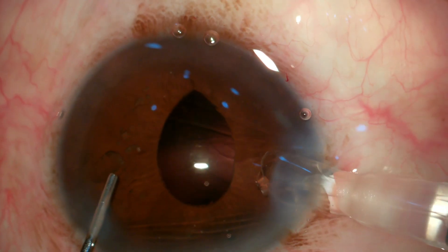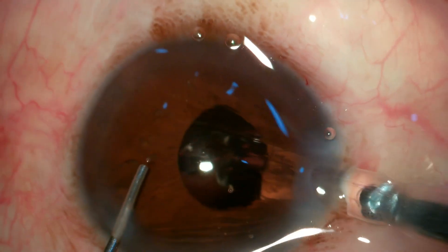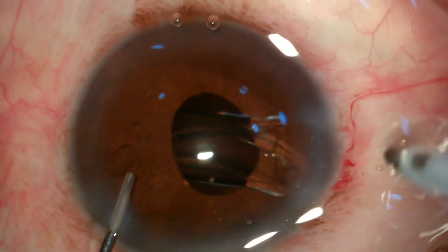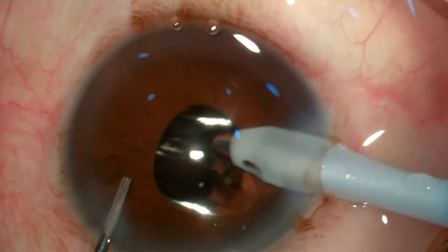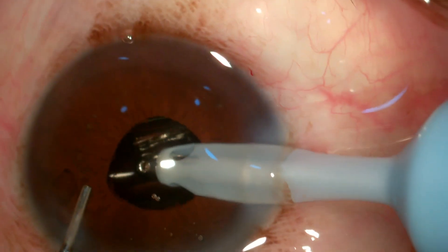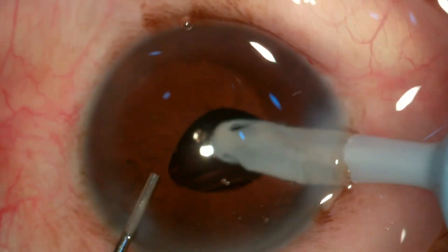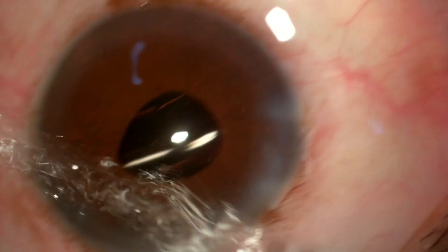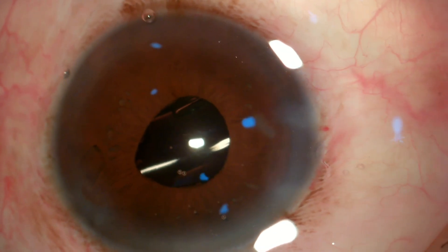This is my technique of IOL implantation where I'm using a 26-gauge needle and implanting a hydrophobic Johnson & Johnson IOL in this patient with very minimal viscoelastic. A little bit of irrigation and aspiration, then just tapping the IOL into the bag — and as you can see, this is almost the end of the procedure and the pupil is round and circular without any notches.